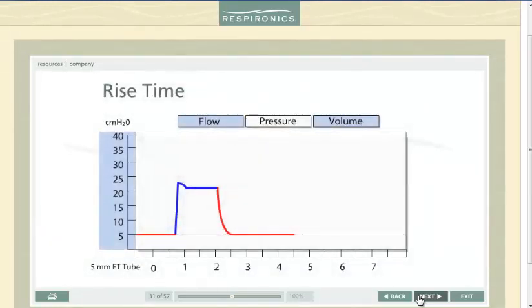If the rise to pressure is too fast, a pressure overshoot can occur. Although the small pressure overshoot is not transmitted to the lungs, it can be uncomfortable for the patient. In pressure support ventilation, the overshoot can end the inspiration prematurely, resulting in decreased tidal volume.